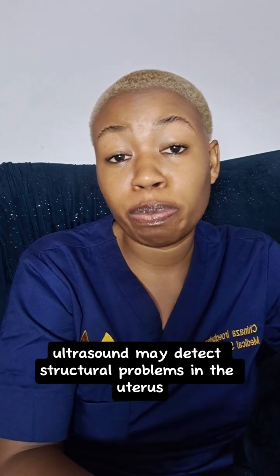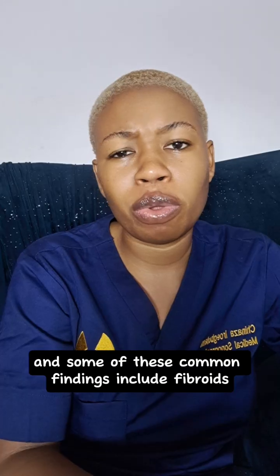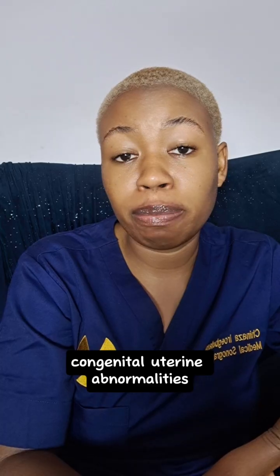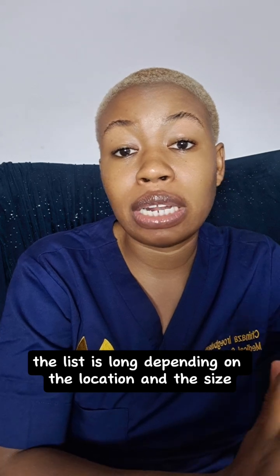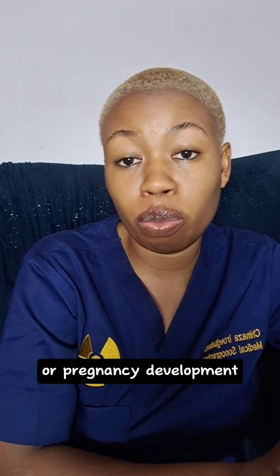Number four is uterine abnormalities. Ultrasound may detect structural problems in the uterus that may interfere with pregnancy. And some of these common findings include fibroids, that is uterine myomas, endometrial polyp, congenital uterine abnormalities, adenomyosis, calcification. The list is long. Depending on the location and the size, these conditions may interfere with implantation or pregnancy development.